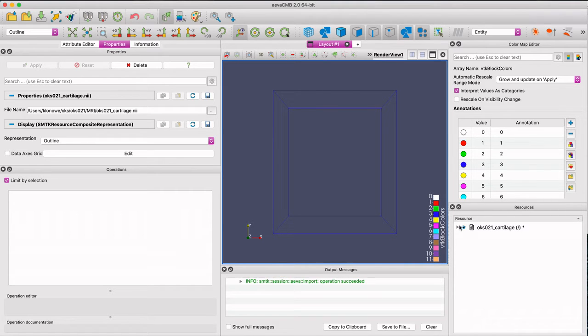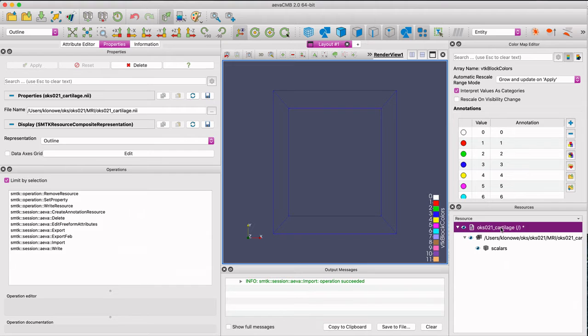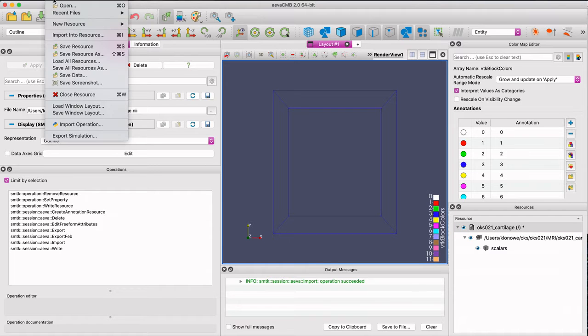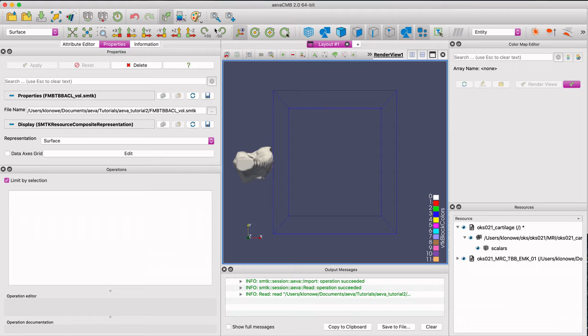First, I load a nifty file which contains a volume of MRI slices, for now represented by the outlined cube. Next, I load an SMTK file that contains three STL files with three smooth surface meshes.